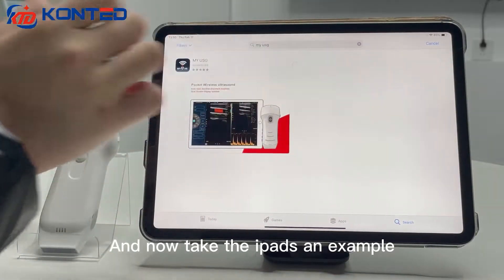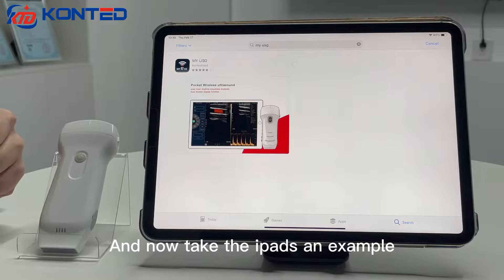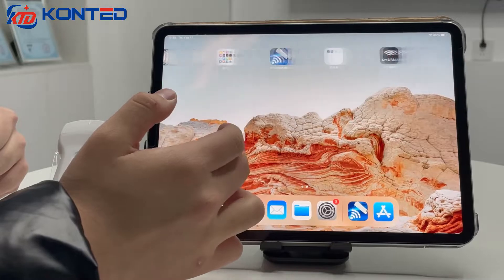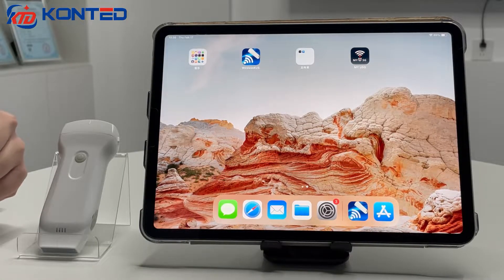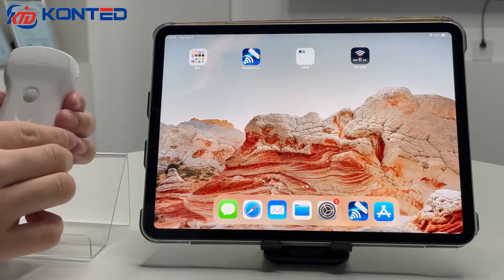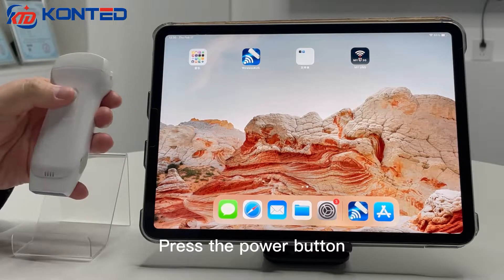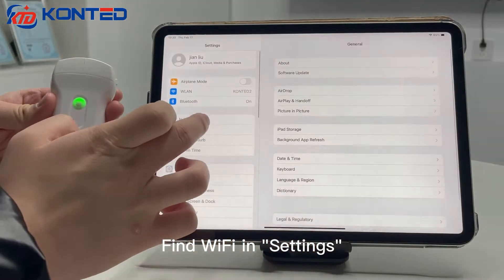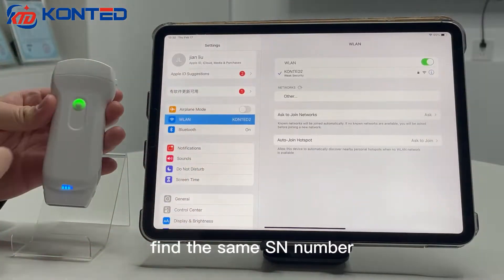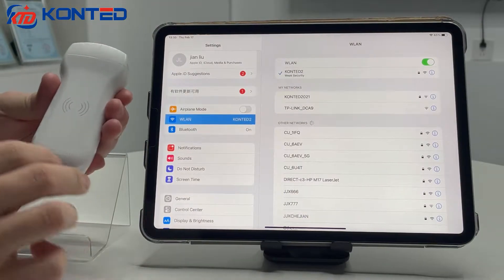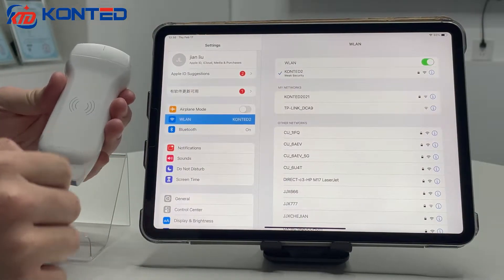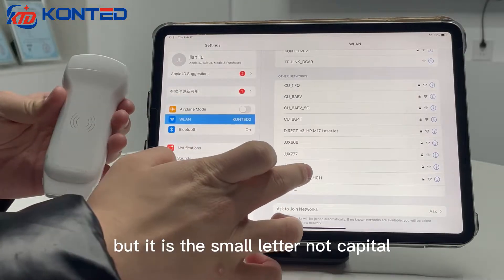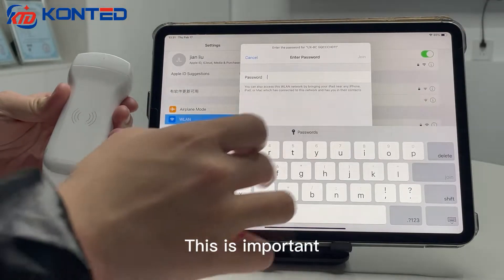Now, take the iPad as an example. To connect the probe, press the power button, then find Wi-Fi in settings and find the same SN number. The first word is the SN of the probe, but it's in small letters, not capitals. This is important.